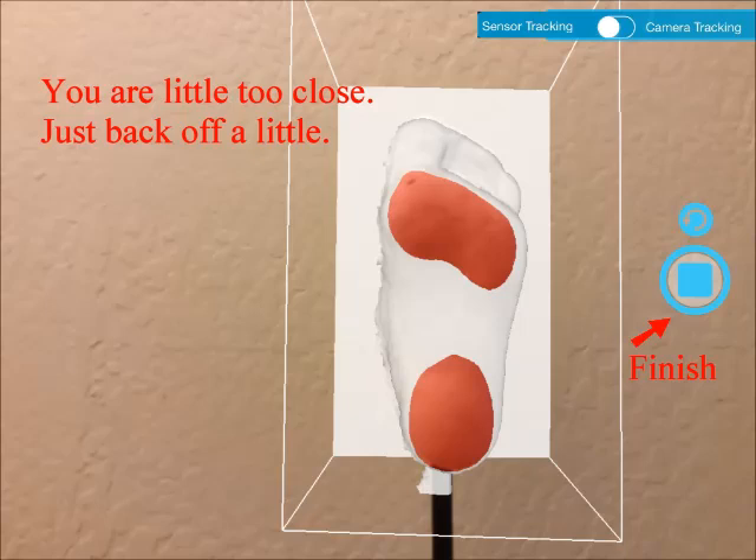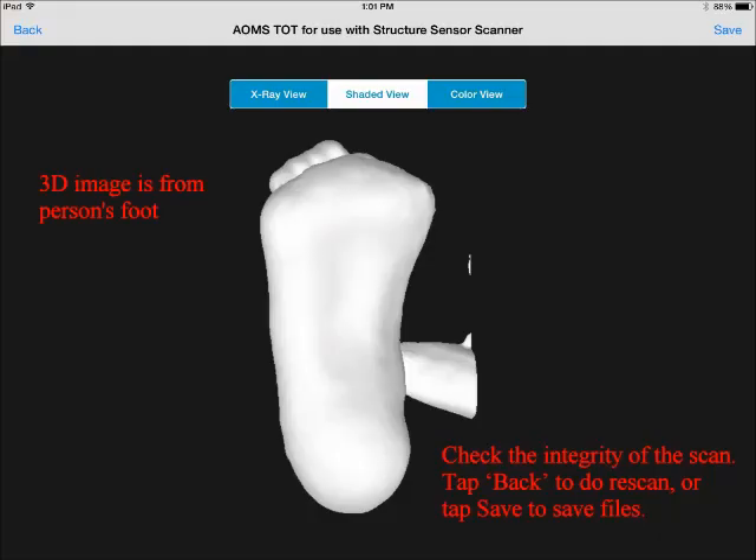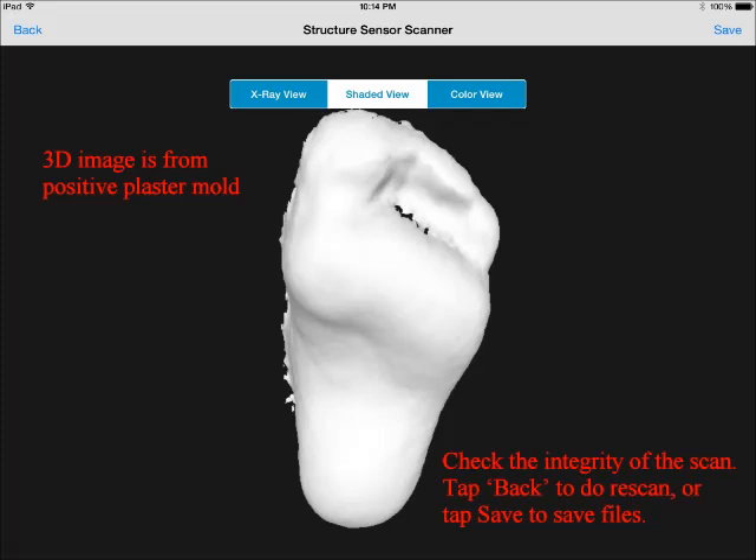Close range will give you high resolution in the image. If everything is alright — that is, the data is rich, the shape is not distorted, and there are no voids — you can tap the finish button to continue. After tapping the finish button, you will see this screenshot. At this moment, you check the integrity of the image. You can choose to do a rescan if the image is not ideal, or you can choose to save the image. Note that you may see artifacts — that is, something that doesn't belong to the foot. In most cases that is okay, because the processing software can extract the foot image. Just make sure the foot image is outstanding — closer to you than everything else, with everything else in the background.